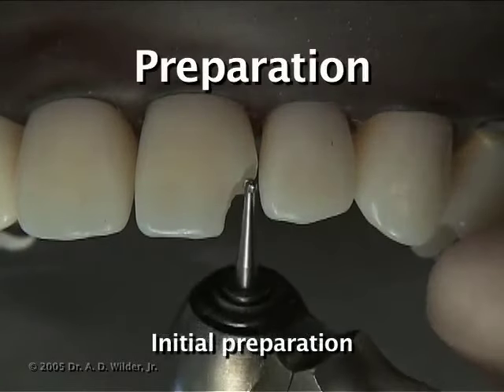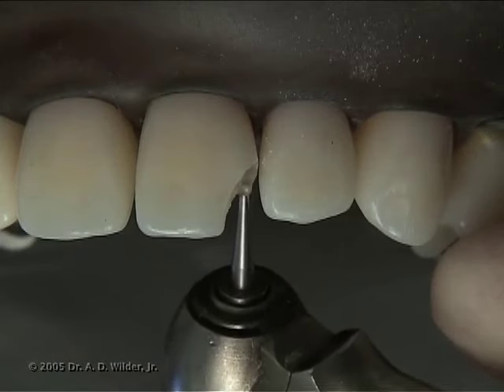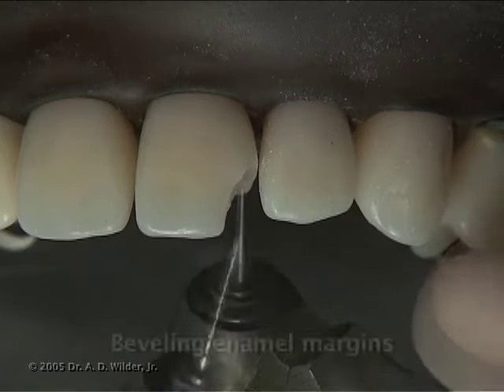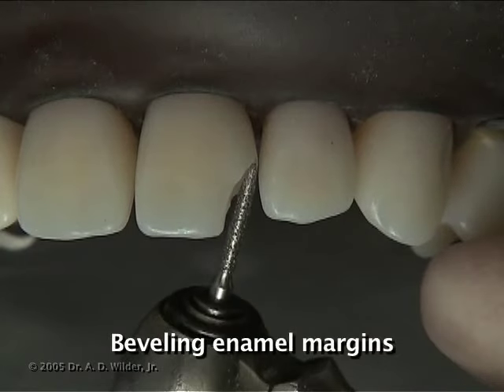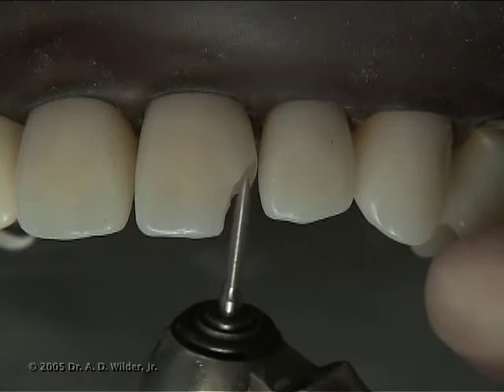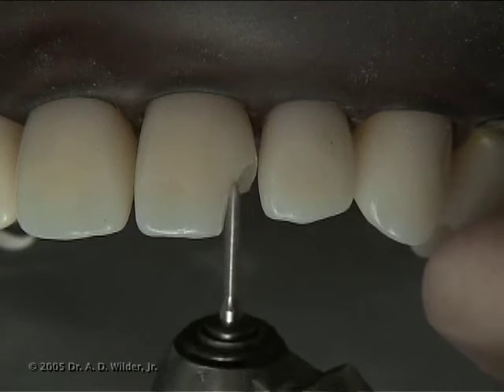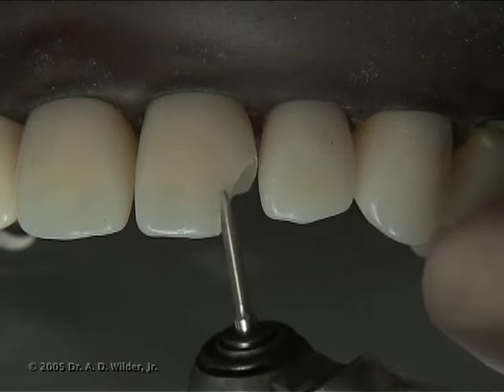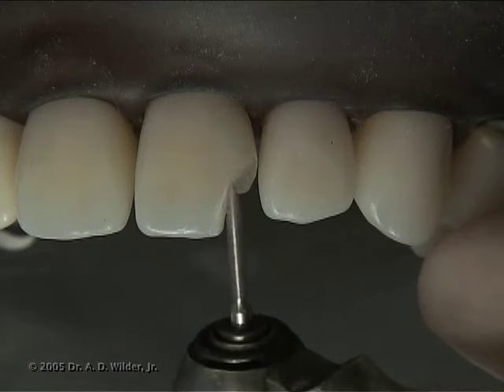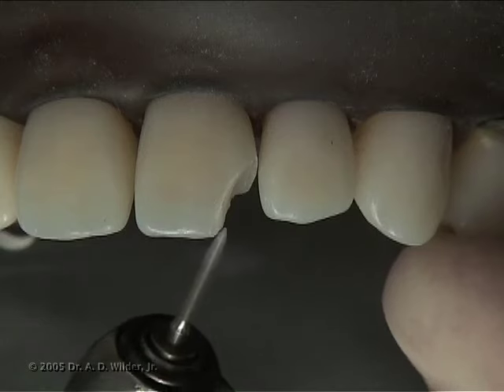After anesthesia and isolation, use a round bur or 330 diamond in a high-speed handpiece to smooth the sharp edges and remove any unsupported enamel. Then use a long tapered diamond bur to bevel the incisal and facial enamel margins. This involves placing a 1mm slanted edge in order to increase surface area and thus improve retention of the composite, and also to provide a more natural and aesthetic blend between the composite and the natural tooth.